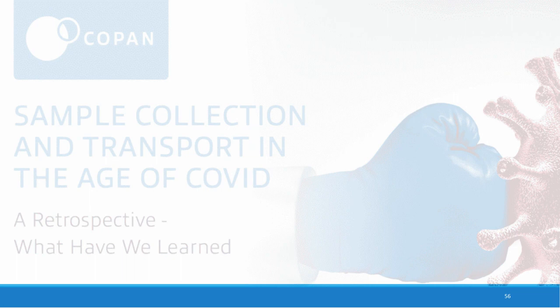Well, that's a good question, and I think that's anyone's guess. I think right now all the home testing and home collection devices that the FDA have put out are all emergency use authorizations. We know that companies now, especially for their assays, are putting in 510Ks to get full FDA approval. As I mentioned, the BioFire is now an assay that does have full FDA approval that includes detection of COVID-19. I would imagine there are more test manufacturers that are working for that 510K clearance, and I wouldn't be surprised if there will be collection methods out there that currently have an EUA that will be looking to get a full 510K approval from the FDA.